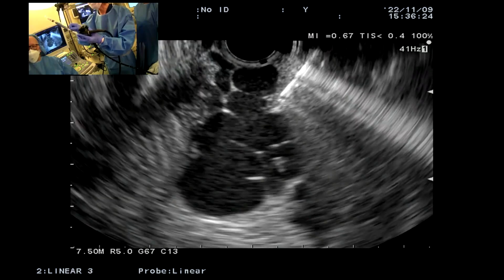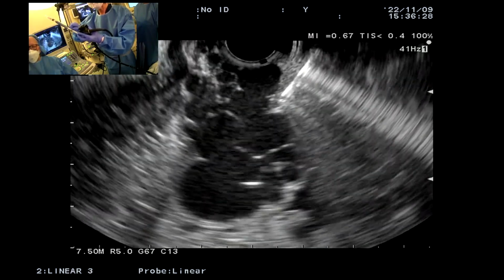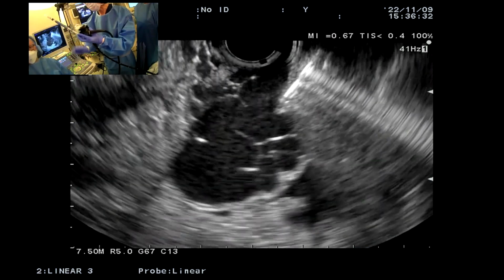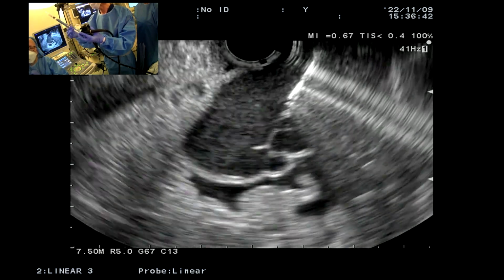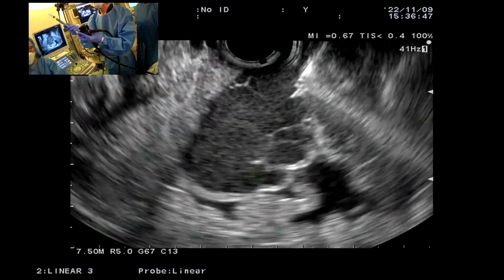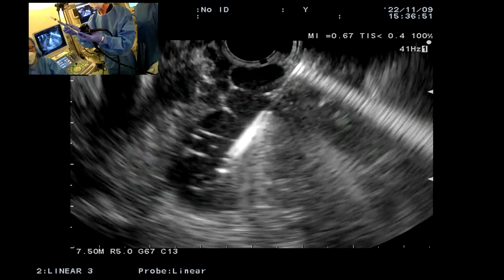So we're going to see if we can get that coil to really go in and fill that entire varix. I'm going to thrust this in there, because I don't want any tissue to get caught on the needle. So I'm going to thrust this in, and you can just measure this out just to be sure that you're not going through the varix on the stomach end. So this is 2.8. So I've dialed in about that same amount. So let's now go ahead and thrust in. There it is. Okay, good.